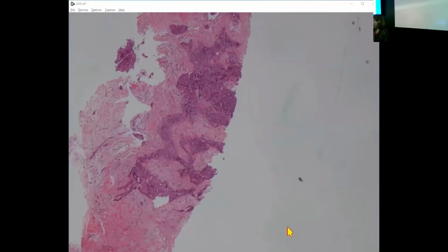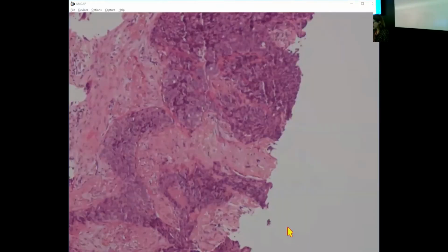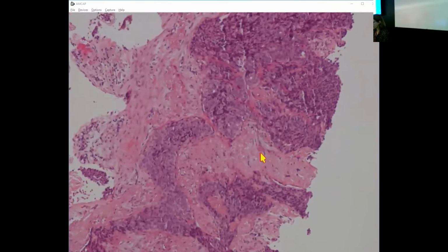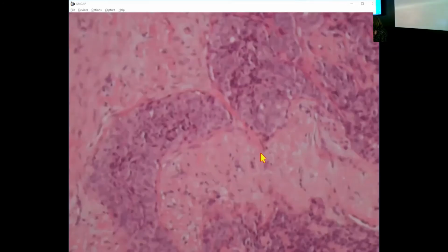But as I was trying to point out, if you've got hyalinization of the stroma, maybe it's not so easy to see on the screen, I always try to think about the possibility of a benign sclerosing lesion first, because you don't want to have somebody over-treated or treated unnecessarily. Of course, you can make the argument the other way. You don't want to miss invasive carcinoma either, but I think starting that way and then going from there.